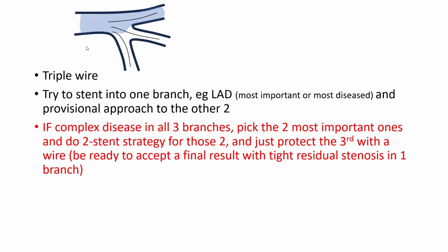I will explain a general technical approach for left main trifurcation. There are no standardized papers on trifurcation approaches, unlike bifurcation approaches. So I will use my personal judgment in describing those approaches. So those are general rules. Again, it's a trifurcation where all three branches are important. You may have disease only between the main branch and one of the side branches, or all three side branches may be involved, but I'll describe the general approach to all those scenarios.